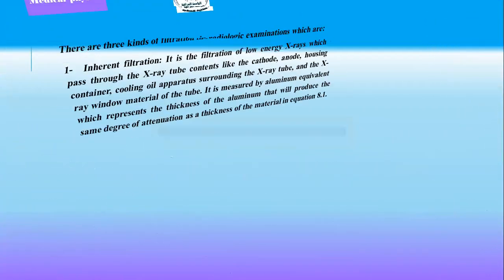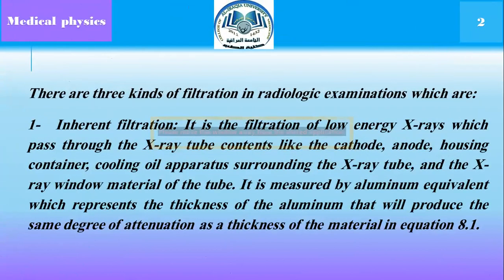X-ray filters are used to selectively attenuate or block out the low energy photons during X-ray imaging.